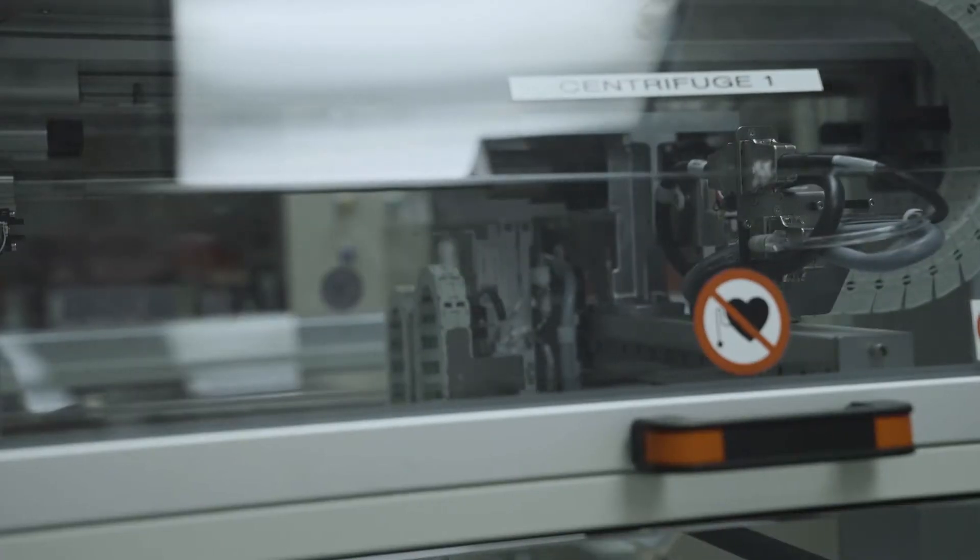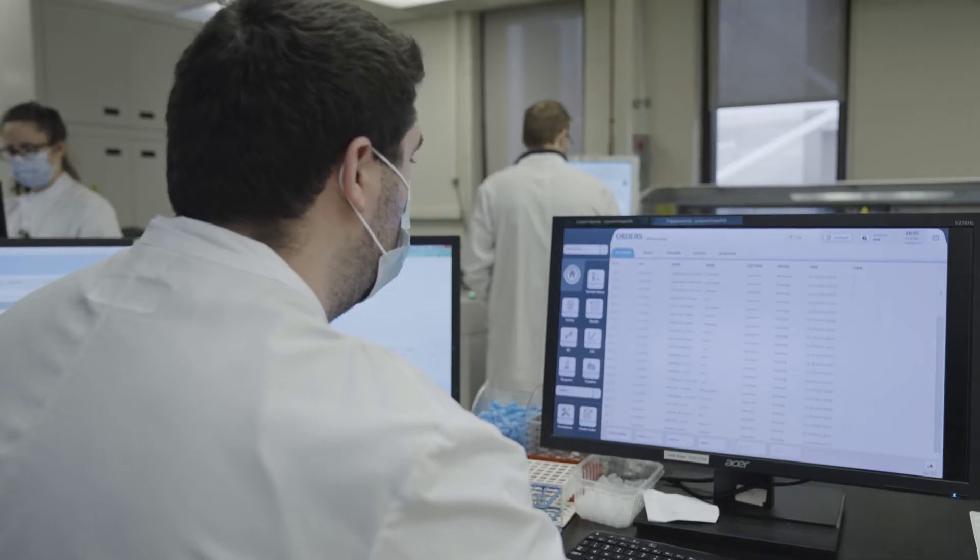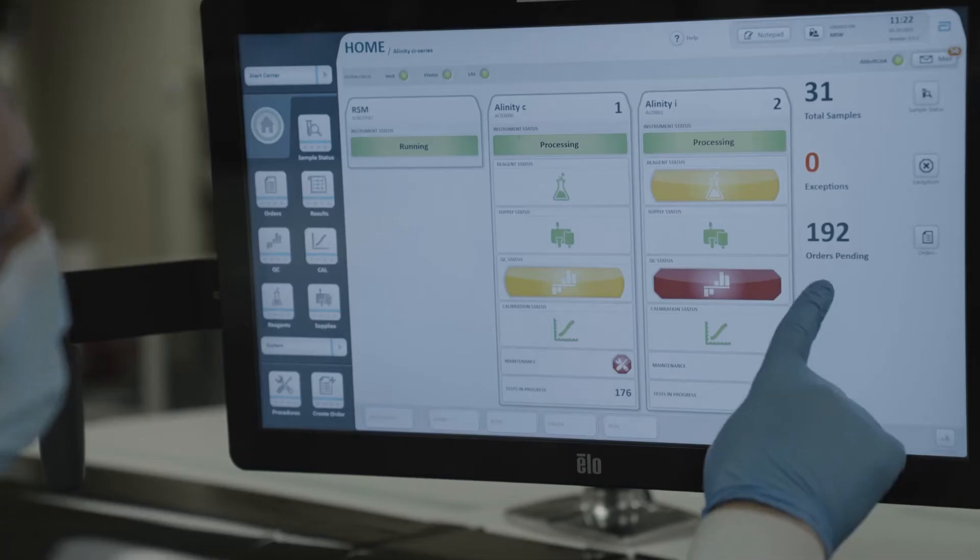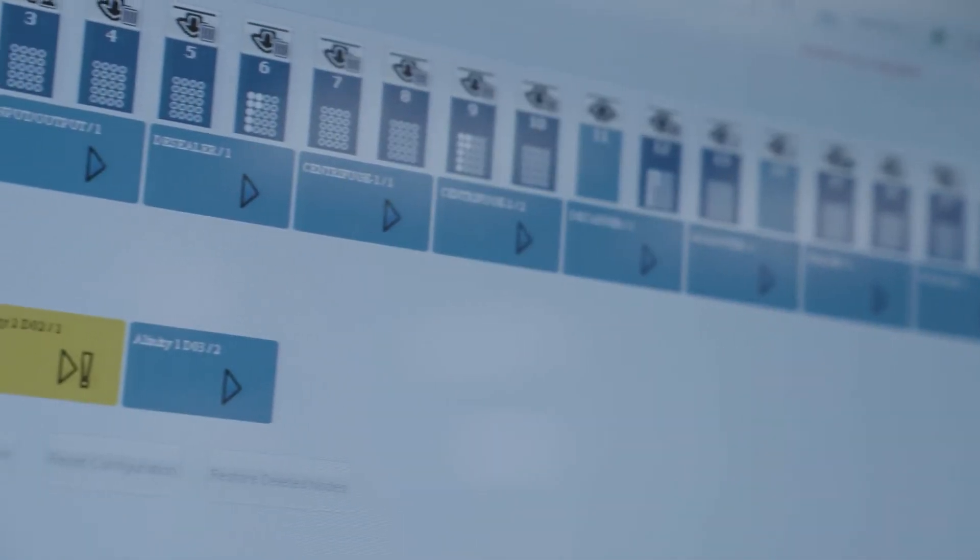After a specimen is done processing, it goes into storage and doctors can put in orders for additional testing and we keep the blood up to seven days.